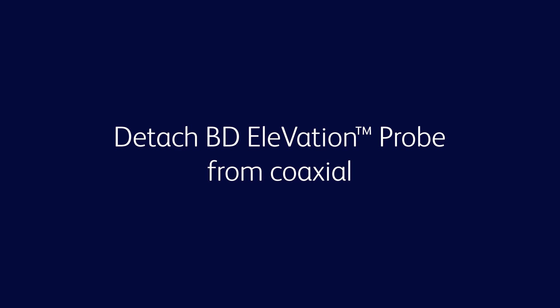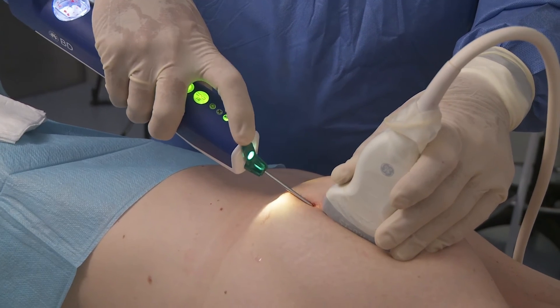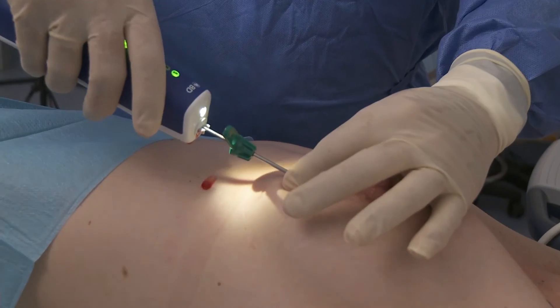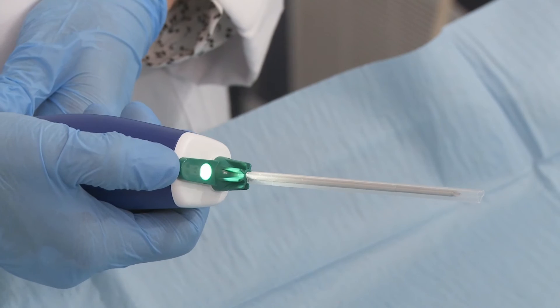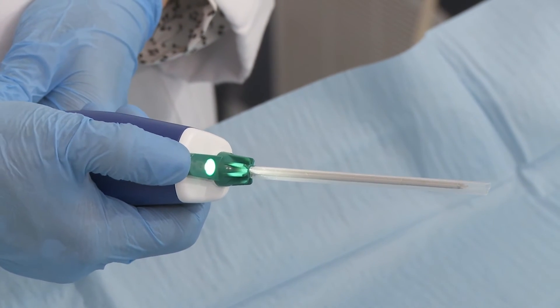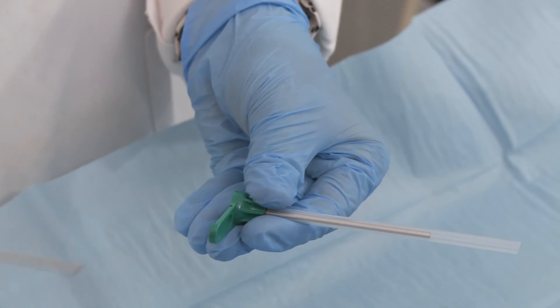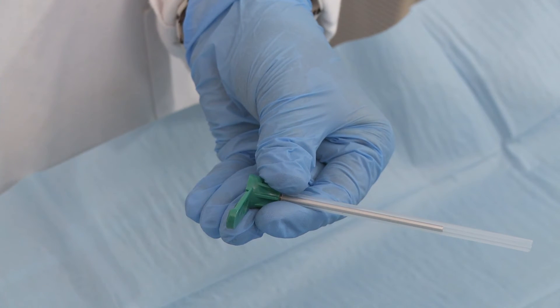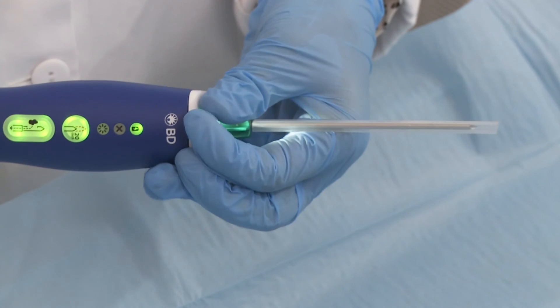Prior to removing the BD Elevation probe from the breast, the support cannula may be detached and remain in the breast to retain a track to the biopsy site to place a tissue marker. To remove the support cannula from the probe, depress the coaxial arm and twist the coaxial hub. If needed, the probe can be reinserted into the coaxial support cannula and locked in place.